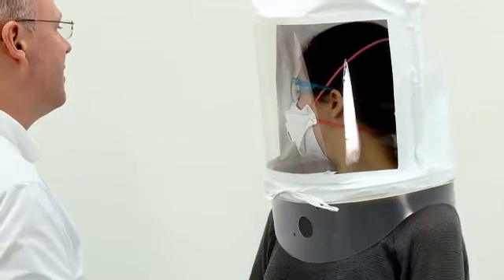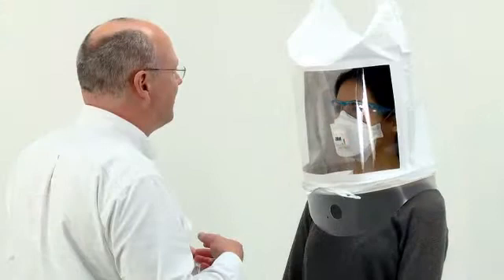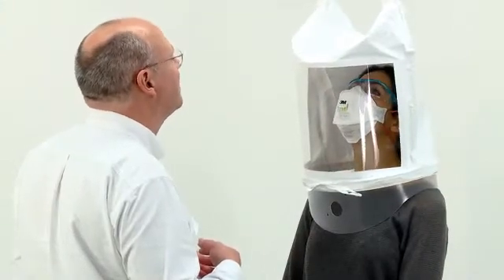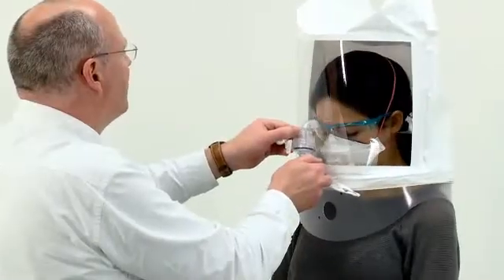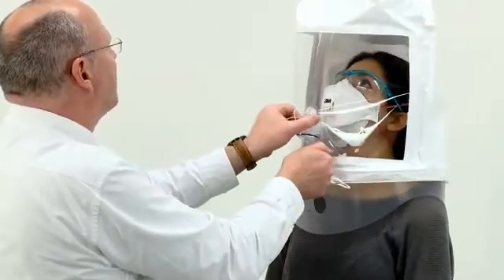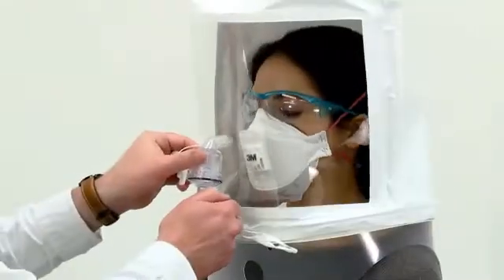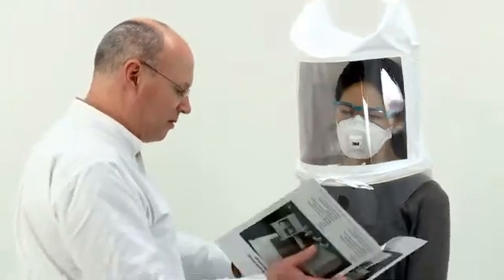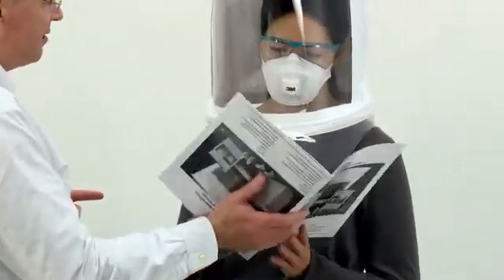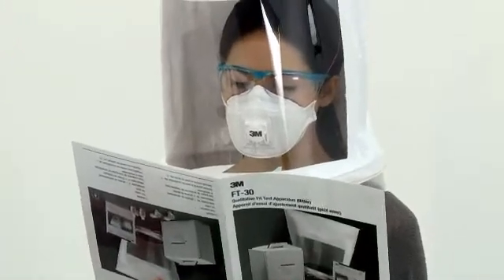Again, top up the concentration every 30 seconds. After one minute of this exercise, ask the subject to switch to moving their head up and down, inhaling when the head is up. Continue to top up the concentration every 30 seconds. After one minute of moving their head up and down, and while still topping up the concentration every 30 seconds, hand the subject the passage of text in the user instructions and ask them to read it out loud. They should re-read the passage for a full minute.